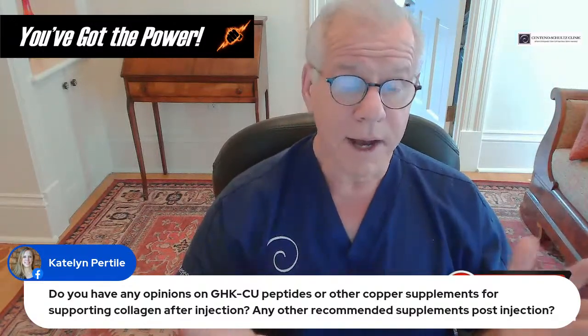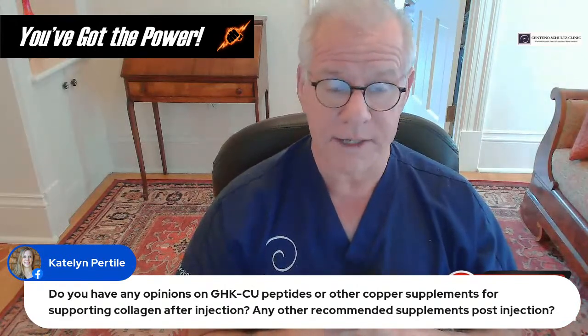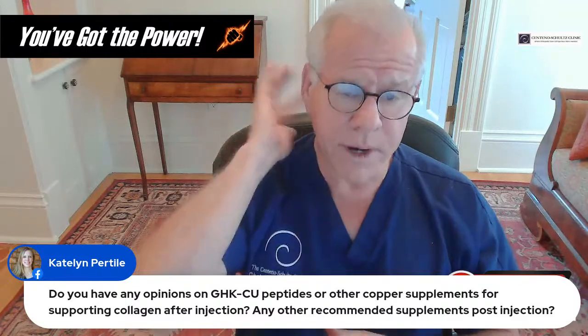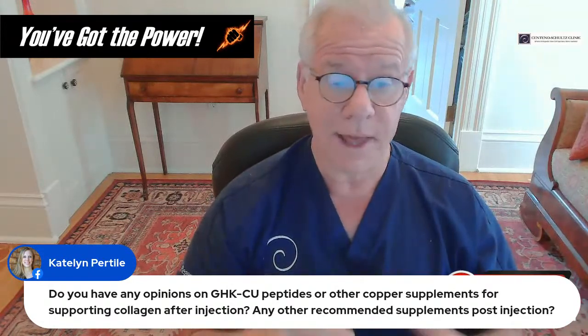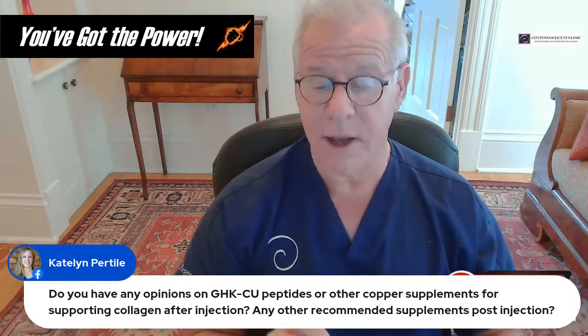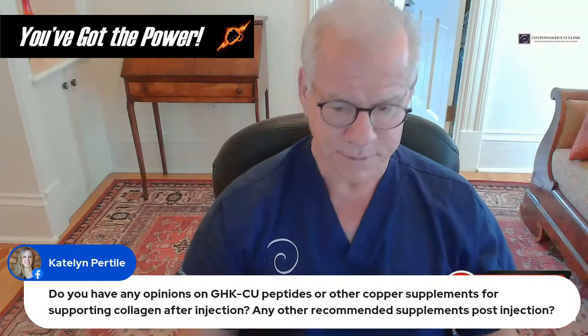So where we are, we talked today about digital subtraction angiography and how critical it was in keeping patients safe and doing C0-C1 and C1-C2 injections. And I showed you an example today of what that looks like and the kind of experience it takes to be able to tell when to inject and when not to inject.